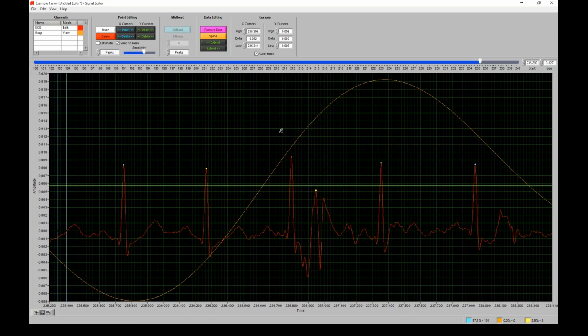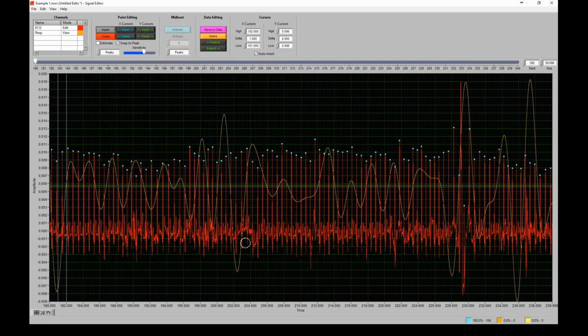So it's a simple delete the bad one, insert the correct one scenario again. I'm going to delete this and then insert this R peak here. Now we can see, even though we haven't zoomed out, that 100% of our peaks are now passing the peak detection, artifact detection algorithms, and that we don't have any remaining that are yellow. So zoom back out, we can confirm that.